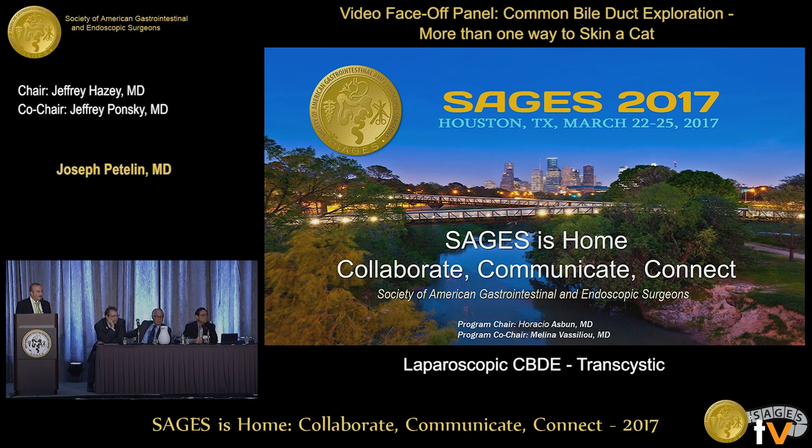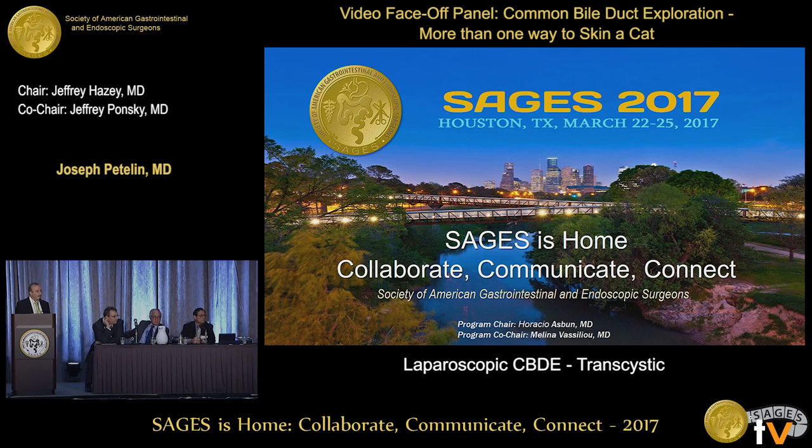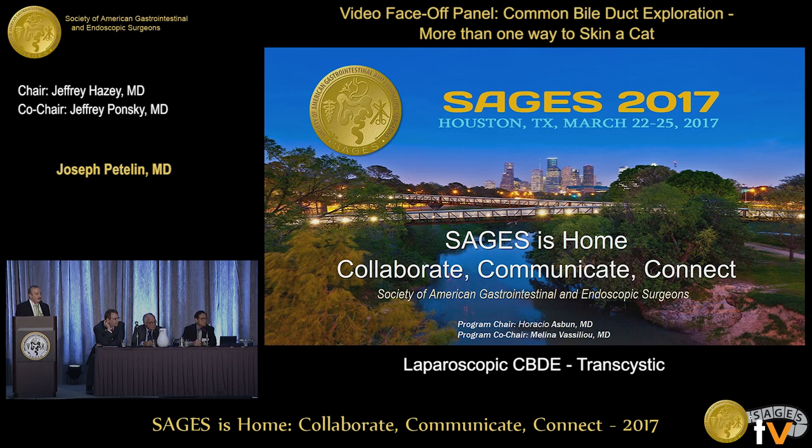Rana Khan from Illinois. I have a question. For CBD exploration, can you close that ductal defect and leave a stent in the CBD instead of a T-tube? Yes, I actually placed the first stent back in 1991. Typical stent, the Allen type stent.